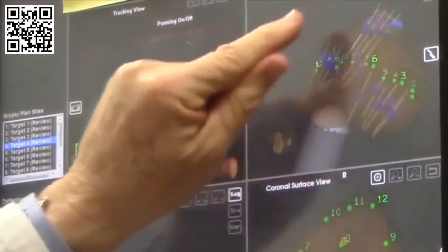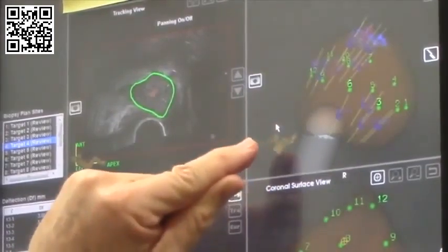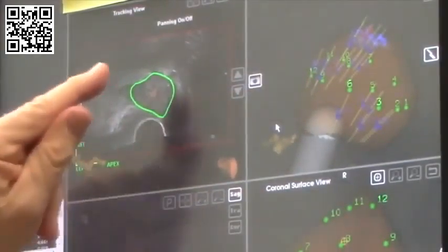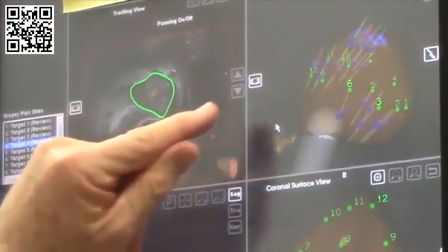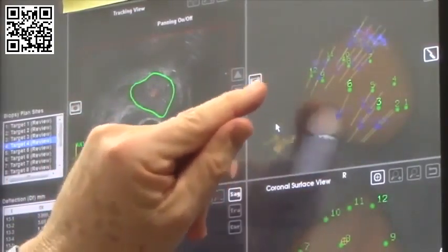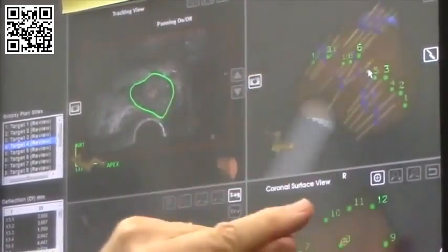This is a 3D reconstructed model of the prostate shown in relation to the ultrasound probe here and body position here. This image is created on the fly by the Artemis device using the video feed from the ultrasound. What we get here that we don't have with a conventional biopsy is this spot, this region of interest here shown on top of the prostate, which is in an unusual location.